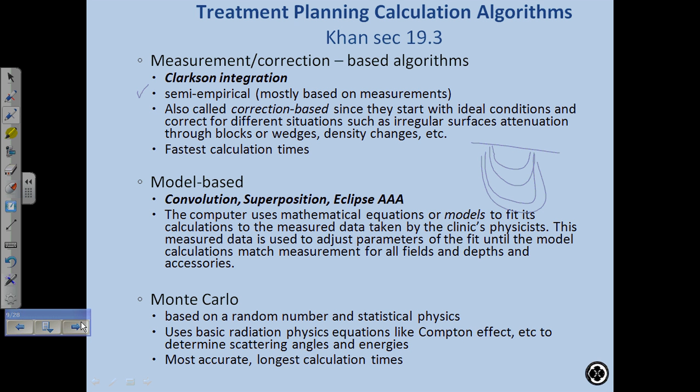Okay. We can do that. And then we can take those isodose curves. In Excel, we can probably come up with a grid, an Excel spreadsheet, and each cell in that grid represents a dose. Then we take that grid and apply a beam coming from this side here, and we can add one spreadsheet to the other spreadsheet and get a sum of doses. Okay, so that's how the Clarkson integration works.